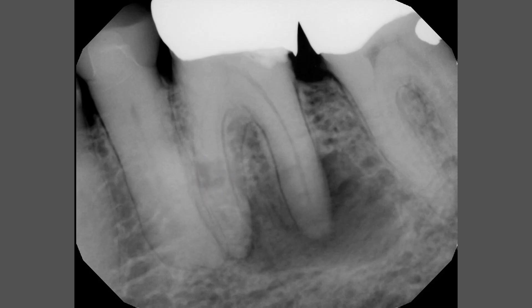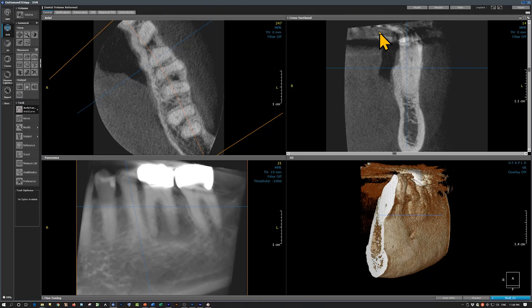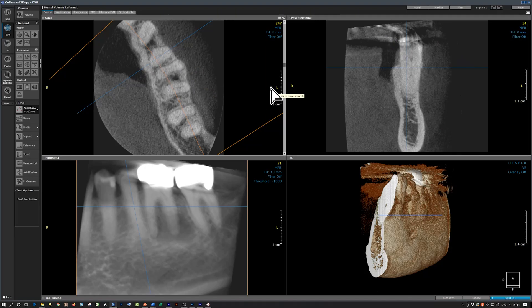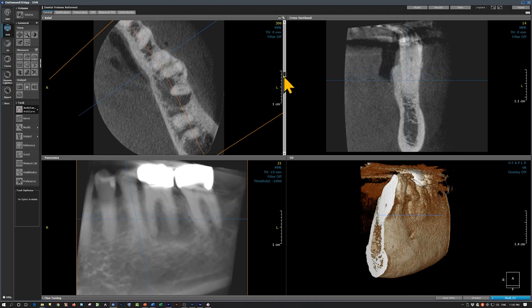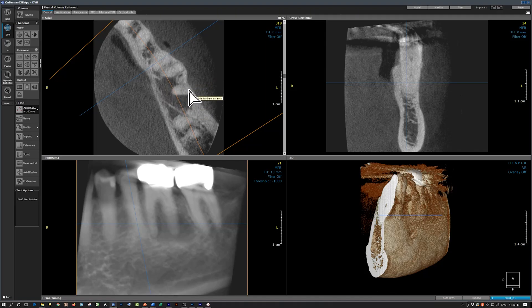Lucky us, we have a CBCT scan to review this area. This blue line represents the image on this window. On this axial view, if we scroll down to the area of the lesion, we see that the lesion is mostly on the lingual and distal, and the tooth may be displaced slightly buccally.